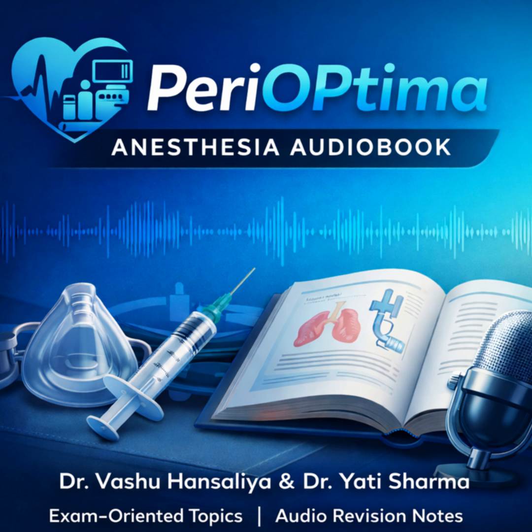And what about patient comfort? You can't forget that. The high rate of postoperative sore throat. It's reported at a significant 17% compared to just 3% with a face mask. So the classic LMA is really indicated primarily for general anesthesia in elective minor surgeries or as a fundamental rescue device in difficult mask ventilation.